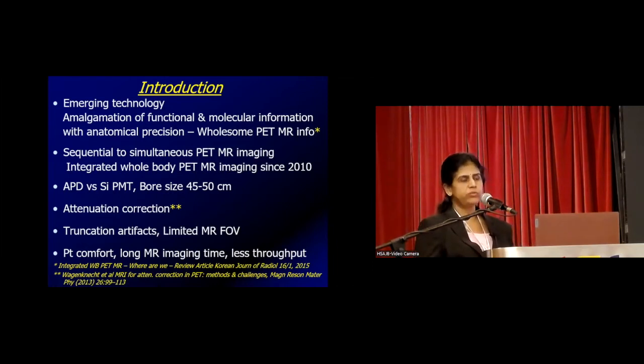evolution and evolvement, there came a day of simultaneous PET-MR imaging. That means it was an integrated PET-MR system, both together in the same system. So the patient undergoes simultaneously both the MR as well as the PET imaging. So this was started from 2010.